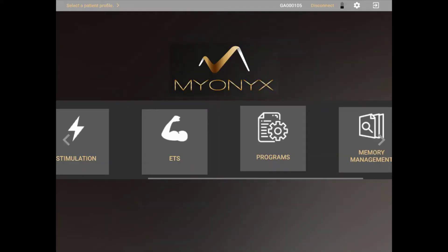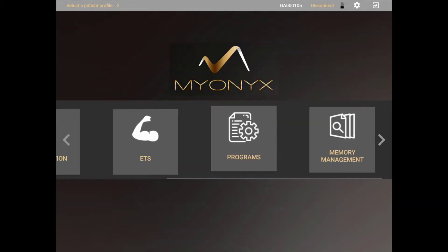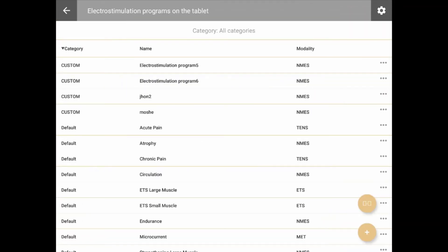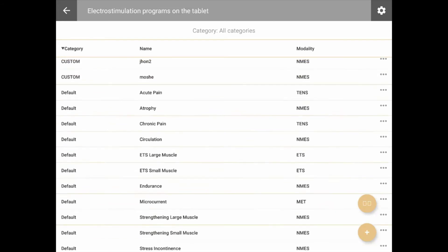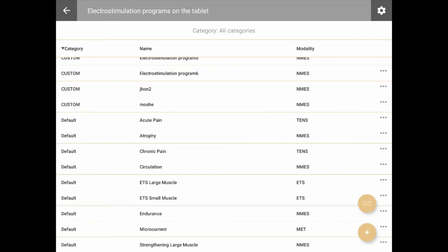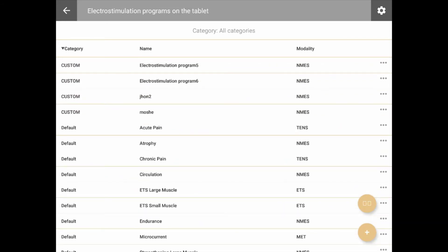Managing electrostimulation programs is done from the Program menu. Click Program in the Home screen. From this screen, you have access to all the electrostimulation programs currently on the tablet. Default programs are the programs that came with the app and cannot be modified or deleted. Custom programs are user-created programs.